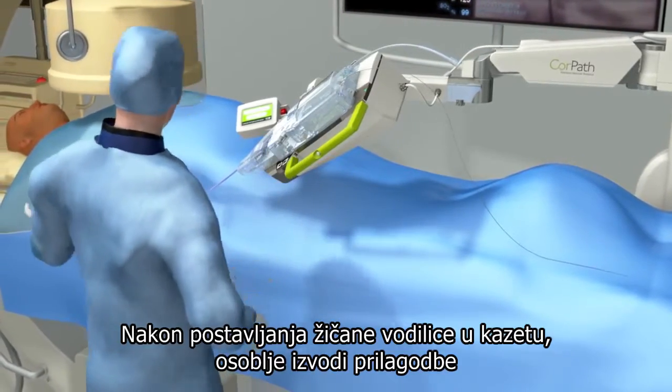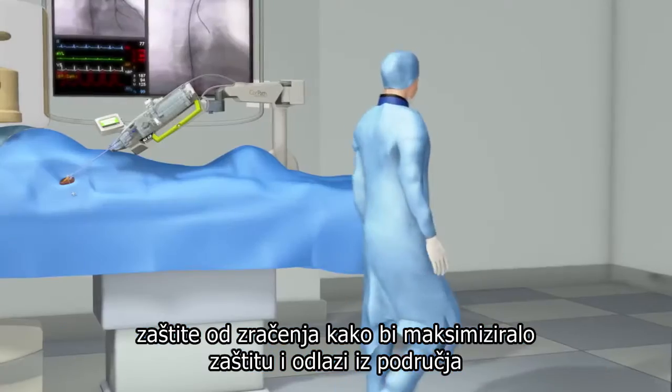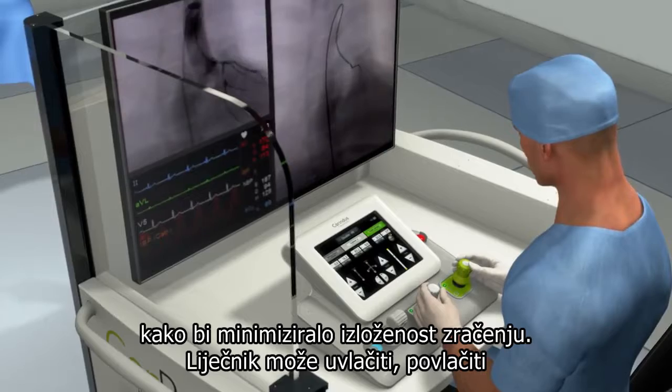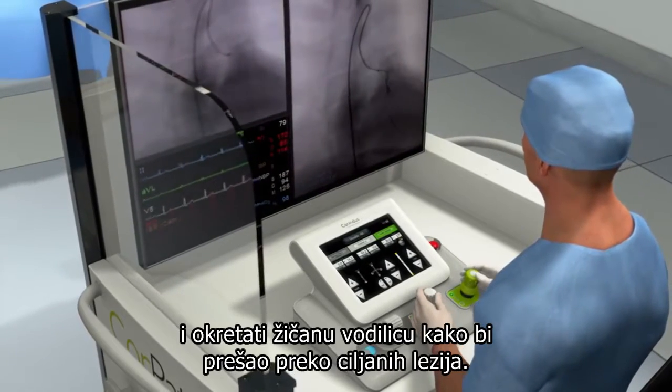With the guide wire position locked in place within the cassette, the scrub staff adjusts the radiation shield to maximize her radiation protection and steps away to minimize her radiation exposure. The physician can advance, retract, and rotate the guide wire in order to cross the targeted lesion.